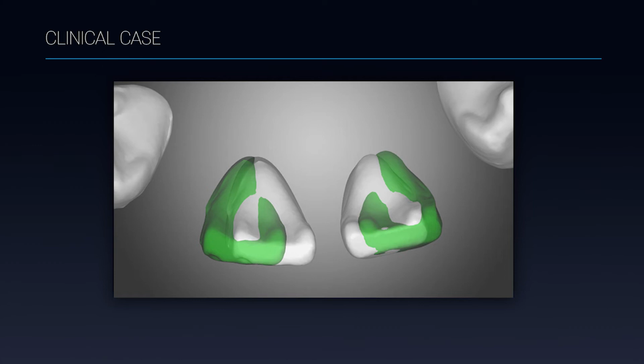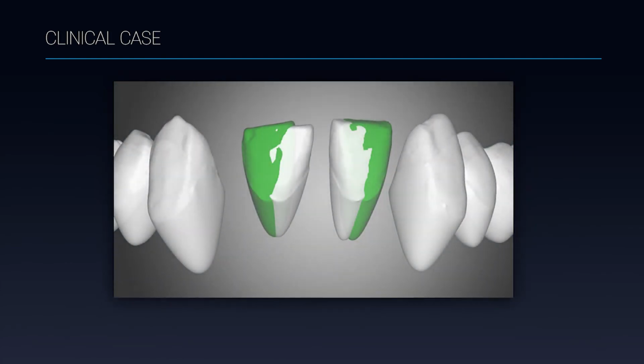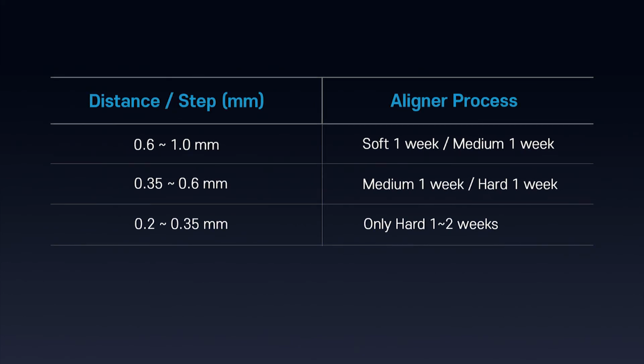When viewed from the occlusal, the movement distance of tooth number 41 is greater than that of tooth number 31. Tooth number 41 is rotational, torque movement, and tooth number 31 is translational, bodily movement. It is reasonable to reduce the movement distance of tooth number 41 with a different movement method. It is recommended to determine the steps based on the bodily movement of number 31 rather than number 41 distal edge. Depending on the material and thickness of the sheet, the moving distance for each step varies.